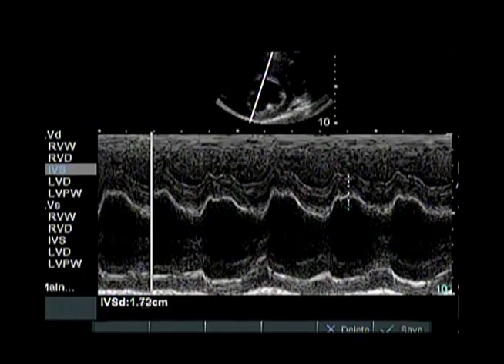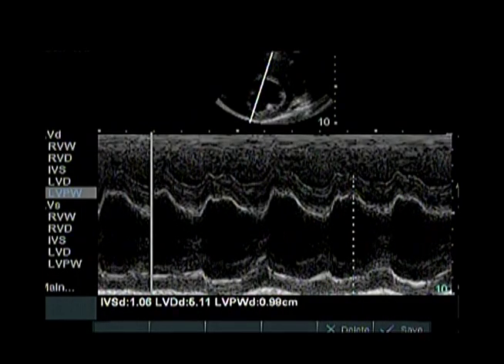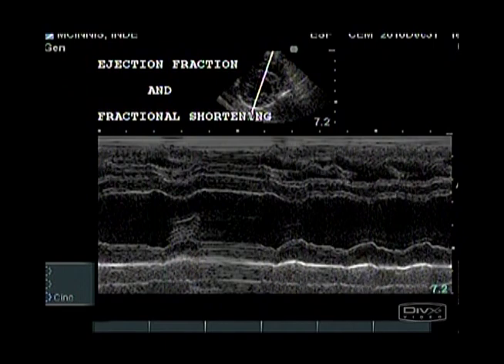This 7-month-old German Shepherd with aortic insufficiency has a larger than normal left ventricular chamber in diastole, proving that the aortic insufficiency is significant. The patient report shows calculations of ejection fraction and fractional shortening made from your Teichholz measurements.